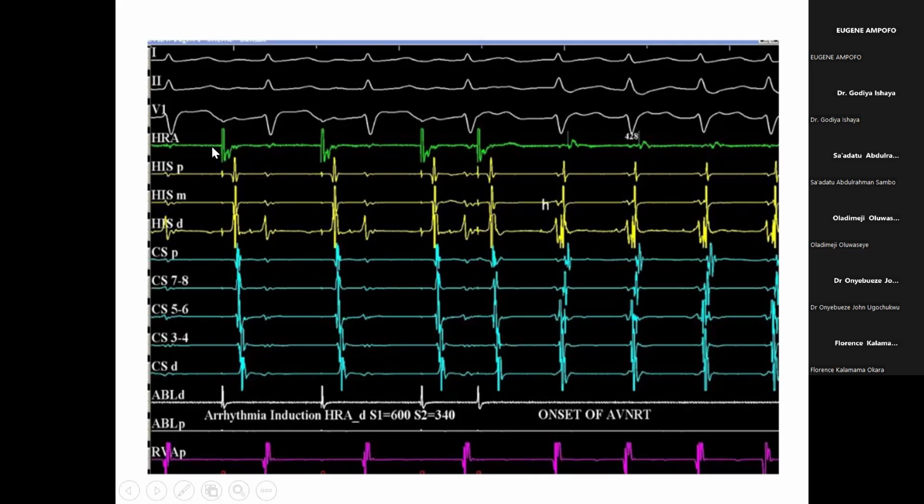So, for example, if somebody has atrial flutter, you would see multiple waves in the HRA even before the next cycle because it's generating flutters, right? We all know the definition of flutter. It means atrial rate is at least above 250, 250 to 300. So you'll be able to see the number of atrial waves that is happening, and you'll be able to say, oh, this is flutter.